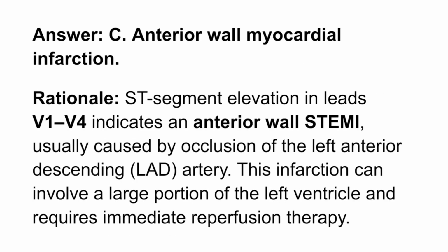Answer: C. Anterior wall myocardial infarction. Rationale: ST segment elevation in leads V1 to V4 indicates an anterior wall STEMI, usually caused by occlusion of the left anterior descending (LAD) artery. This infarction can involve a large portion of the left ventricle and requires immediate reperfusion therapy.